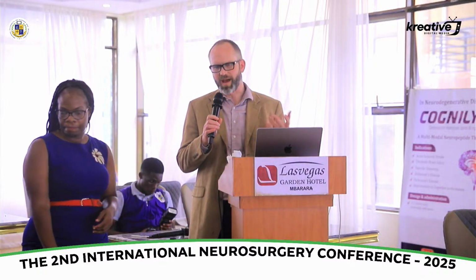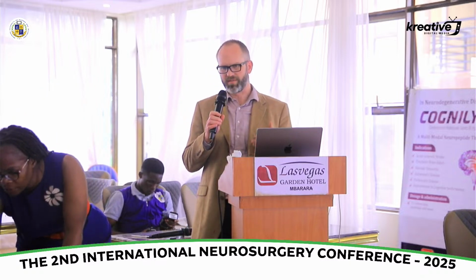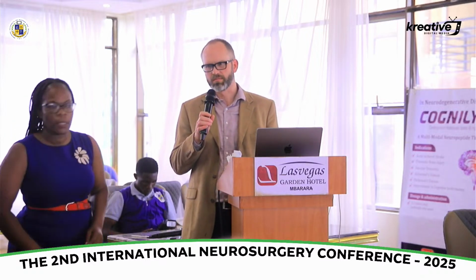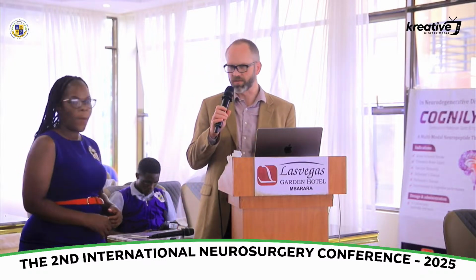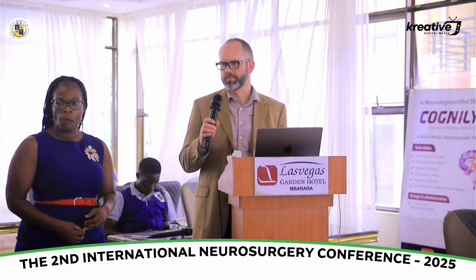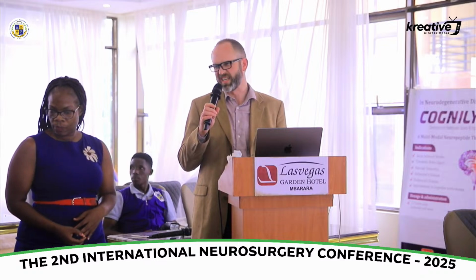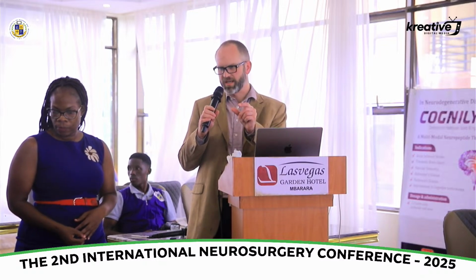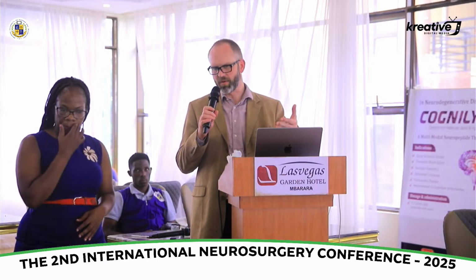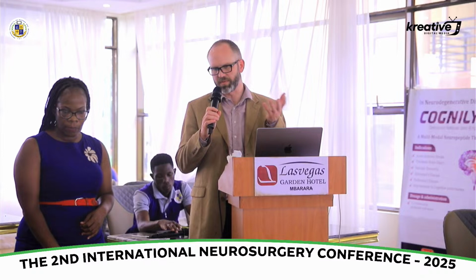And when you're in the operating room and the bone's off and the dura is open, you have superb ultrasound propagation. It works very, very well. You get a lot of attenuation through the skull. When the skin region is swelled, certainly, if you're looking through the skin, it creates more attenuation because you have a thicker space between the skin and what you're looking at. So transcranial Dopplers would be a little harder.